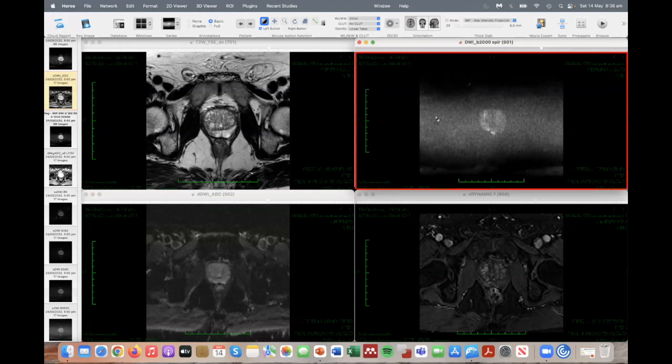Richard, if I can just bring you in on this conversation just while Francesco's loading those images. Richard, do you see many patients in Melbourne who are getting serial MRIs in the context of active surveillance? It's become certainly more popular. Active surveillance came on the MRI schedule for Medicare about the same time that diagnostic prostate MRI came on. So over the last couple of years, it's now more common, but I would not say every year. I would say every 2 to 3 years would be more common unless they've been driven by an abnormal DRE or an abnormal PSA. But yes, it's a significant subgroup, yes.